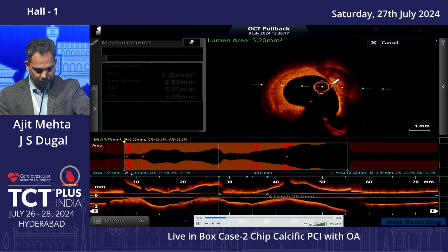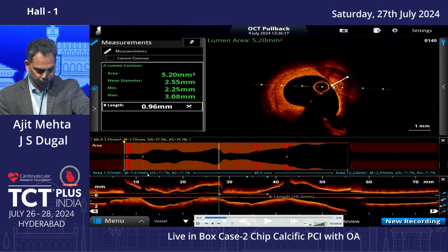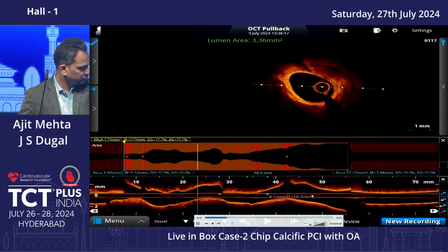Yeah, I mean, I think this is a good OCT where you have to be really cautious because you see how bright it is near the lumen. That's typically going to be lipidic. And then behind it, people assume, oh, this is calcified. But it actually, like, this is not, there are areas.